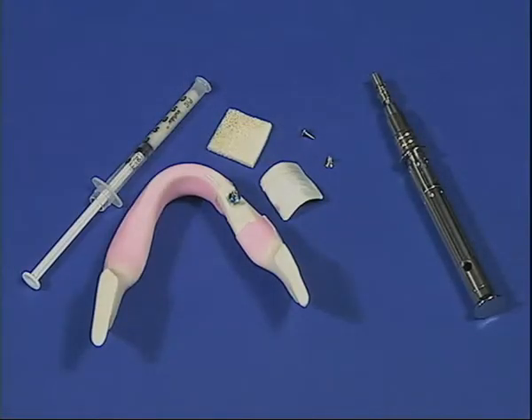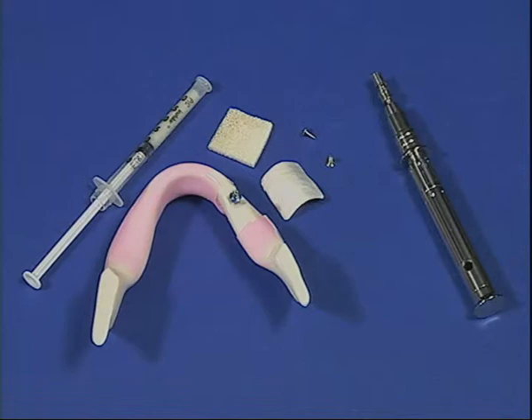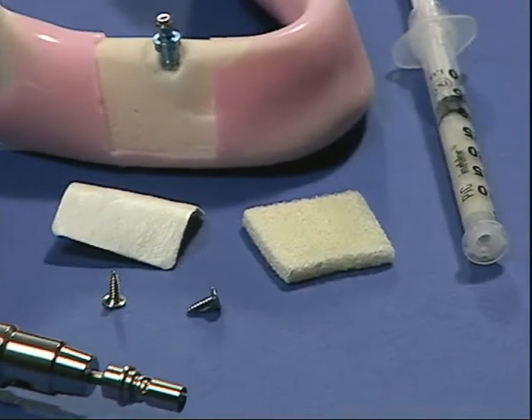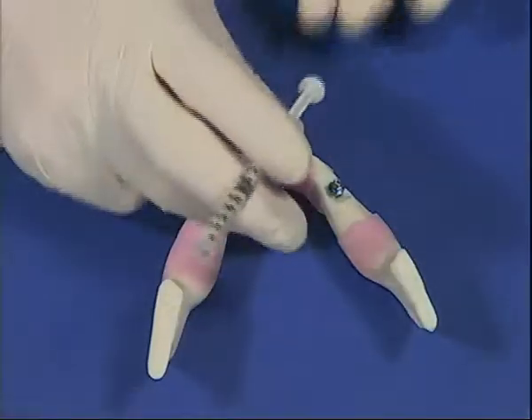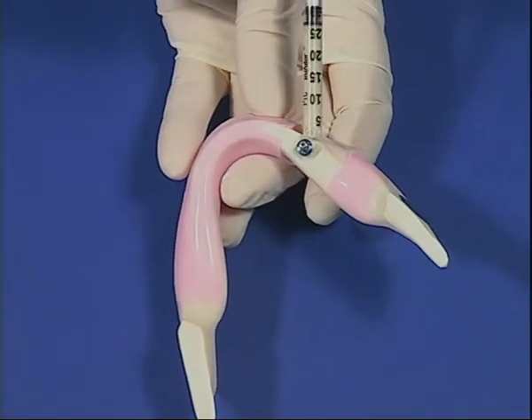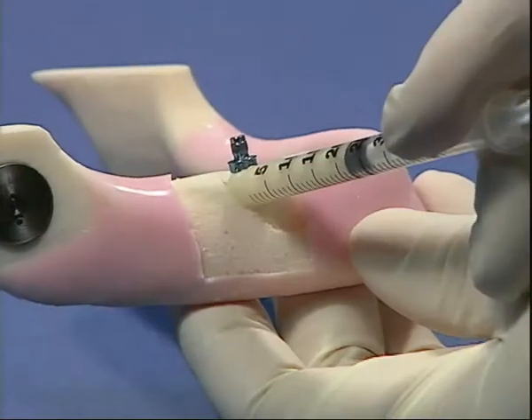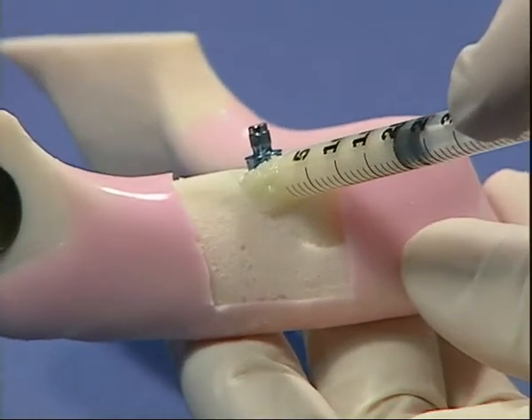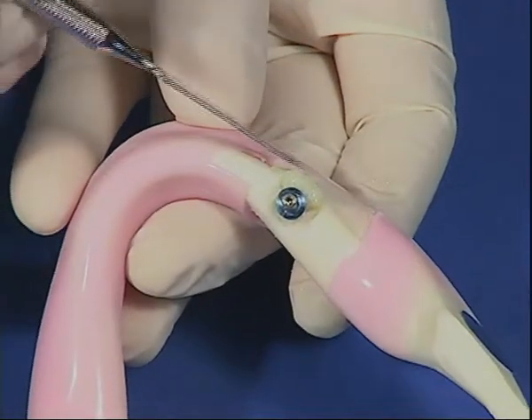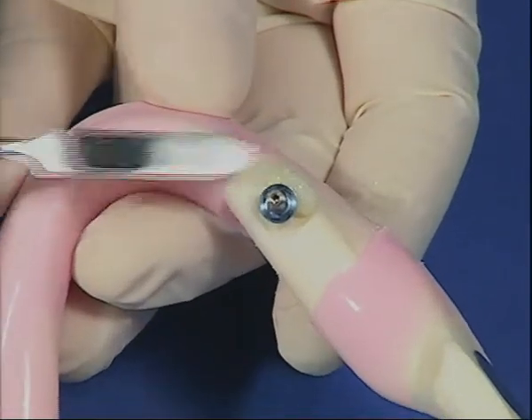You can see how, thanks to the syringe of biomaterial, it is extremely simple to insert a relatively large quantity of granules in the cavity, performing the operation correctly. The material presents itself as plastic and is easy to adapt to the implant site. Insert the material without pressing it too much, filling the cavity, paying attention not to compress, as the aim is to promote angiogenesis.